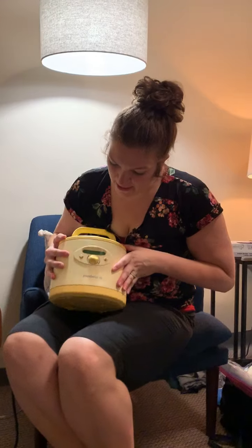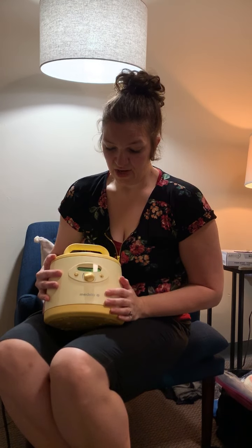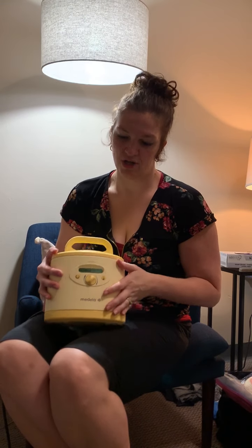When you turn this pump on, it's going to start in the stimulation mode. You'll have three little drops that indicate it's in the stimulation mode — this is a really quick, fast cycle. The only thing you can control is the suction strength or the speed. The slower it is, the less suction force; the faster it is, the more suction.